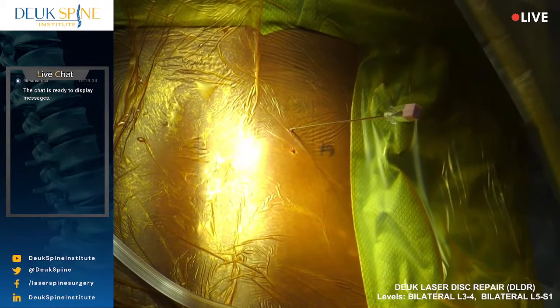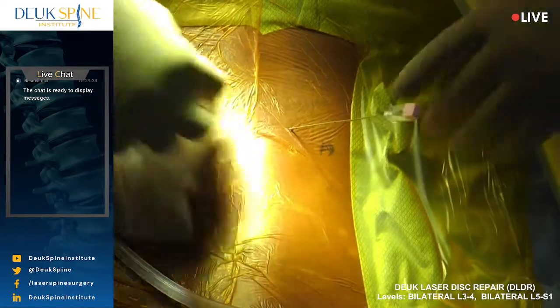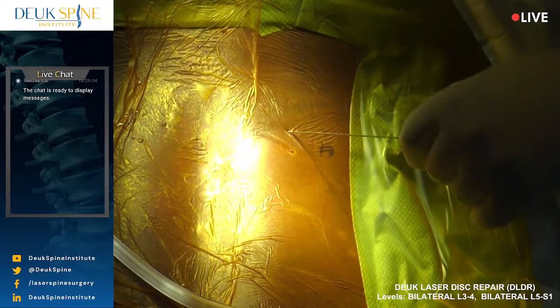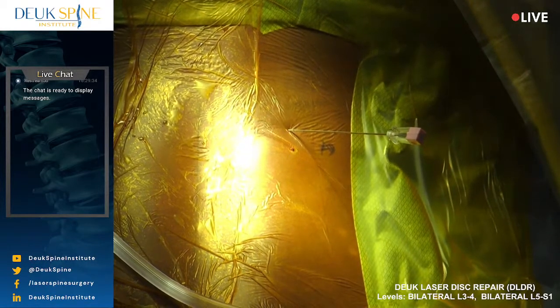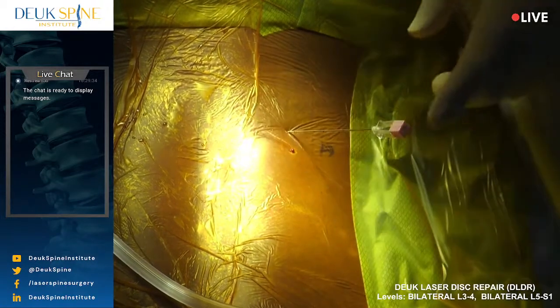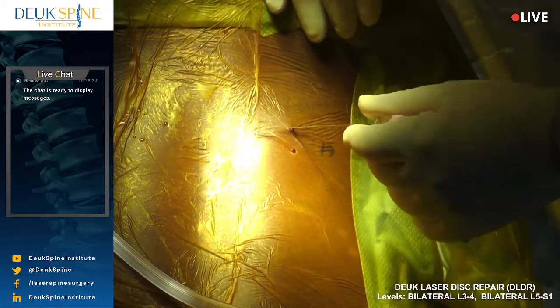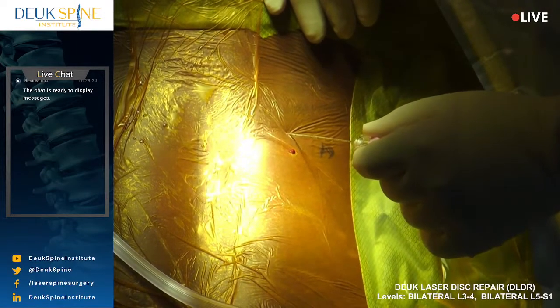You're doing a really good job laying still. Thank you for doing that. I want to get down to the 3-4, and that's going to be, I'm sorry, 4-5. That's going to be the first disc right there, 4-5. All right, so I need to be a little bit lower. Now, I can usually fix 2 discs with 1 little incision, and that's what I plan to do.